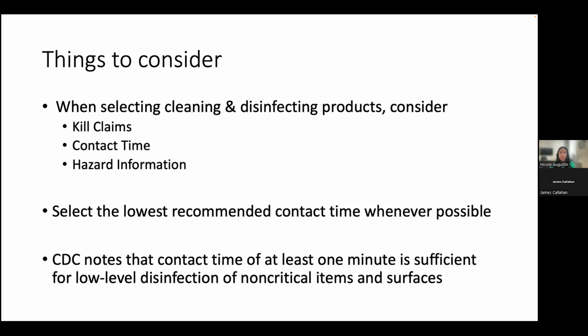Select the lowest recommended contact time whenever possible. CDC notes that a contact time of at least 1 minute is sufficient for low-level disinfection of non-critical items and surfaces. Some products, however, recommend contact times of up to 10 minutes. However, this requires multiple and impractical reapplication of the disinfectant, as most solutions are water-based ones and they normally dry up in 1 to 2 minutes.